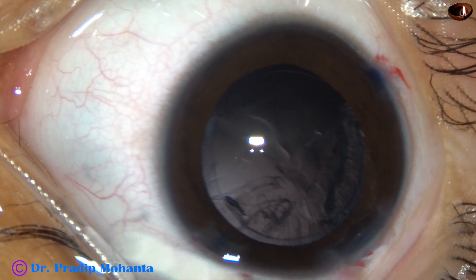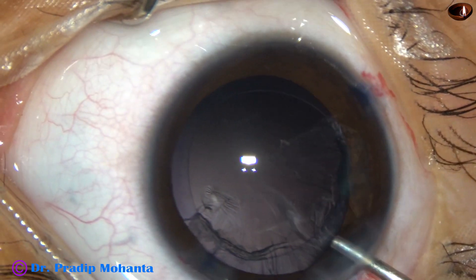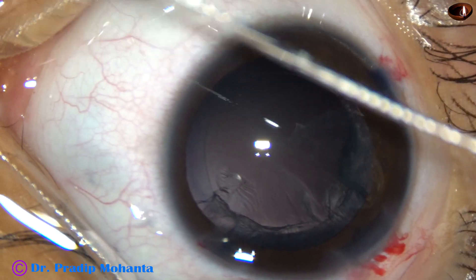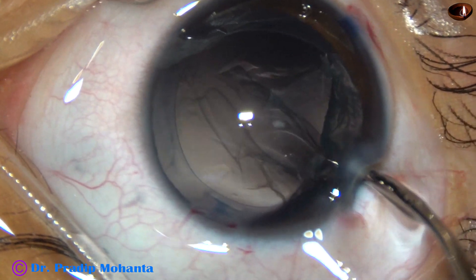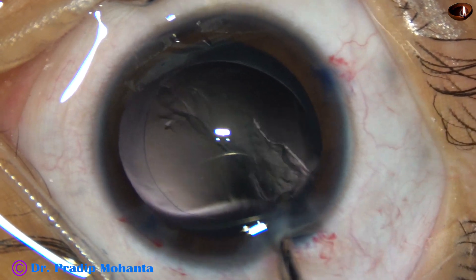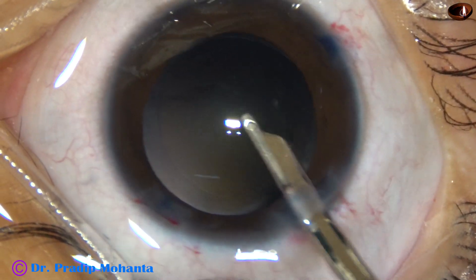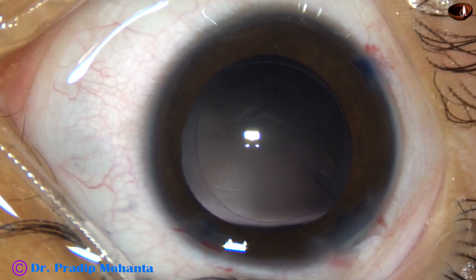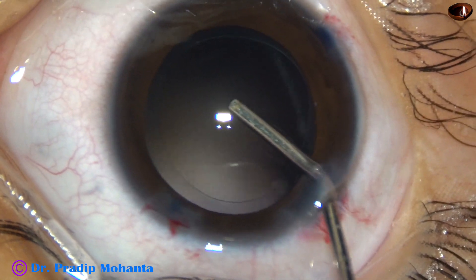Now 2% HPMC is injected again and I am taking a 23 gauge Simcoe to remove this cortical matter. See how beautifully we can remove this — it is just like coaxial irrigation aspiration. Yes, the lens matter has been removed nicely, and now HPMC 2% is injected again.